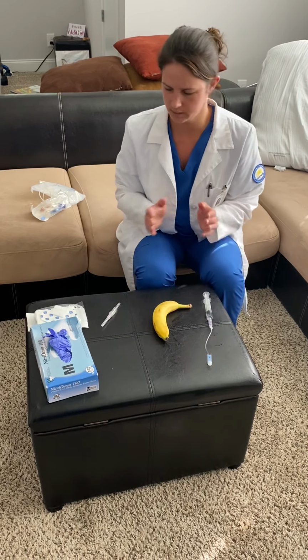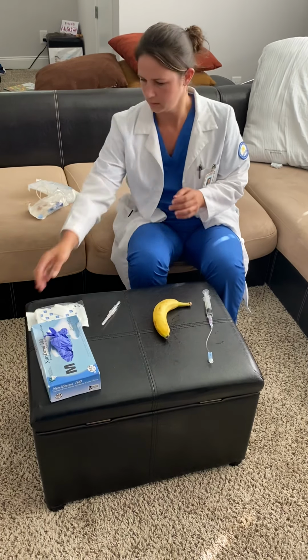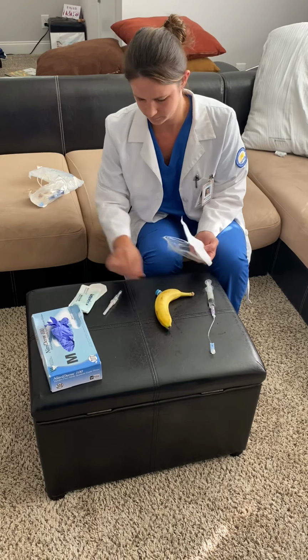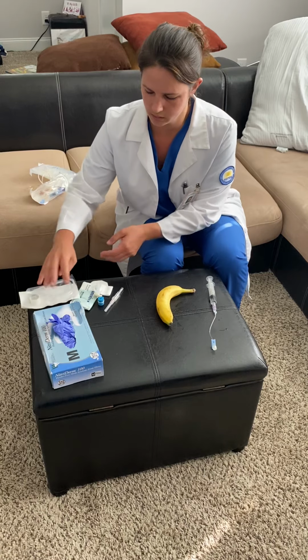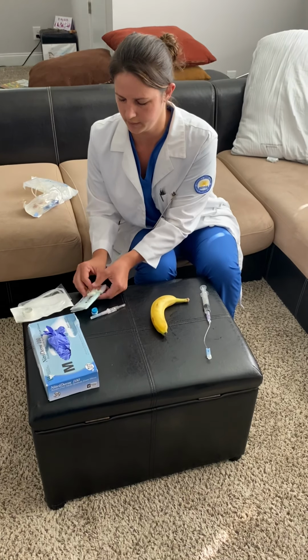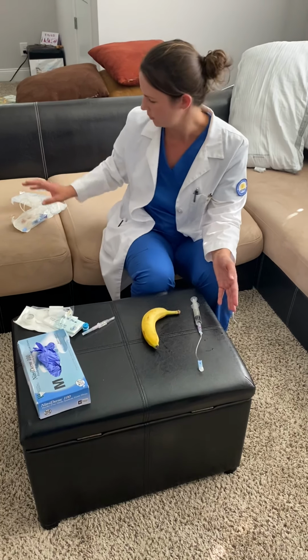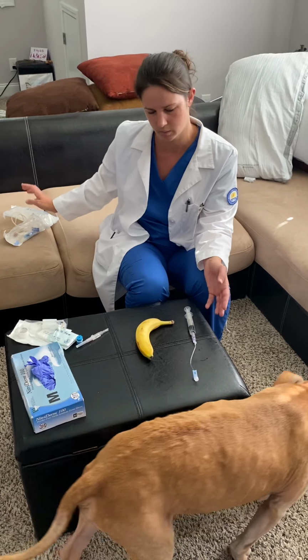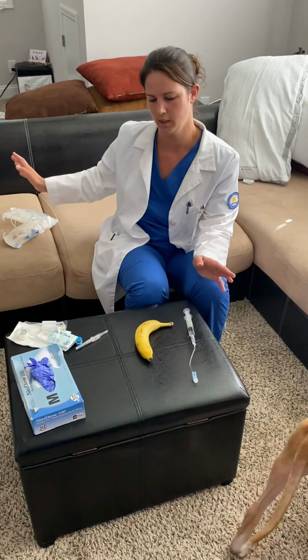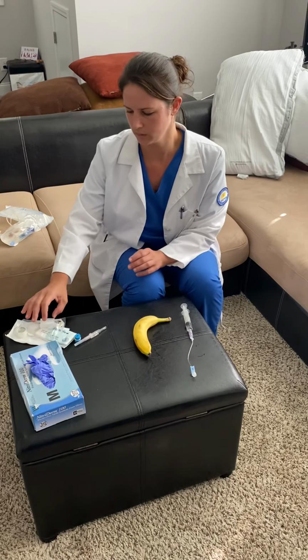And let's see here. I need my tourniquet here. And you also want to make sure that you have double checked not only the IV medication, but your saline fluids, the fluids that you're using. You have double checked, triple checked the order, and the MAR and the Cardex as well, and making sure that you have everything at the right dose.